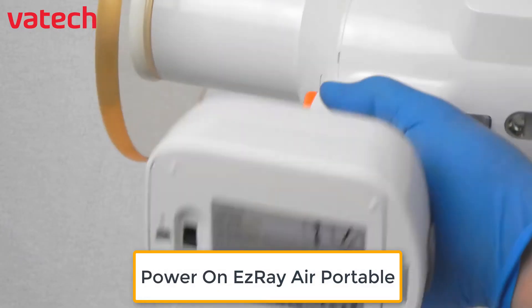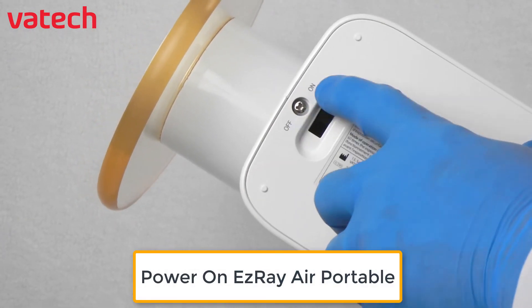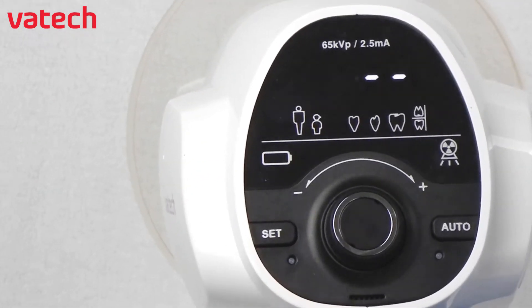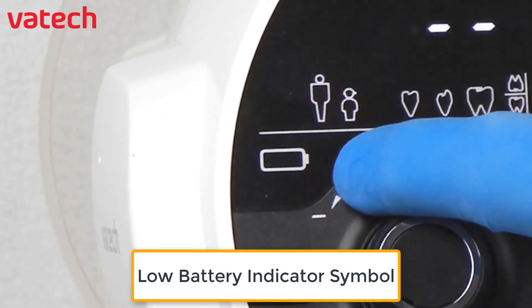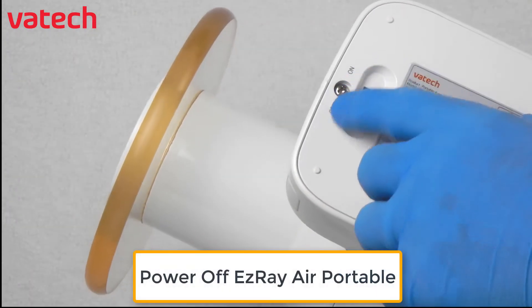To verify if the battery level is low, first switch the device from off to on and observe the back control panel next to the battery level indicator. If a low battery indicator symbol is blinking, the device needs to be recharged.